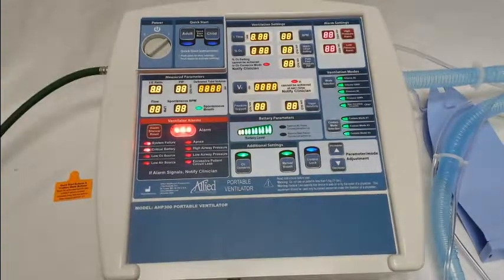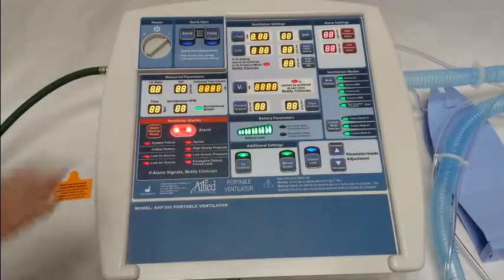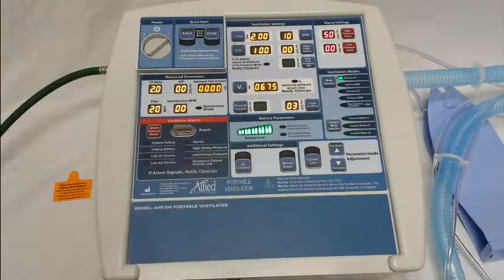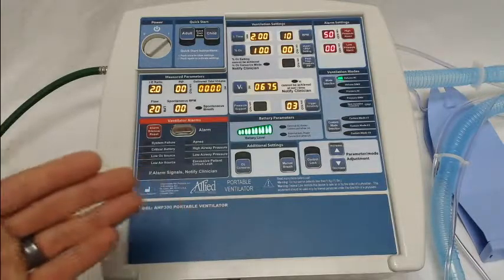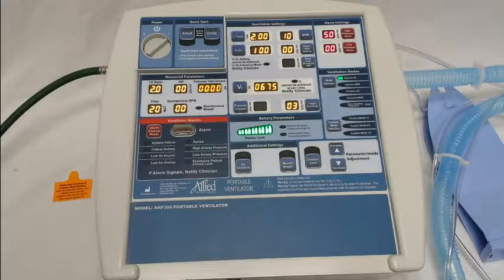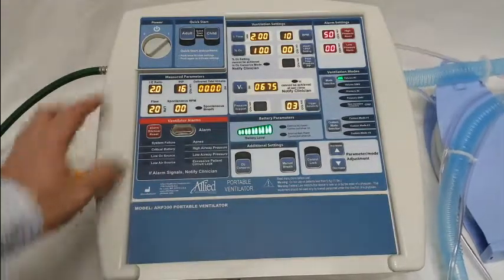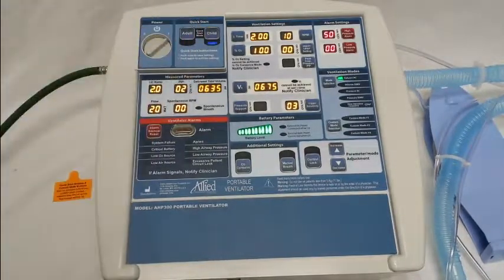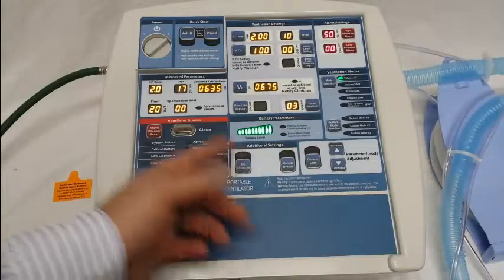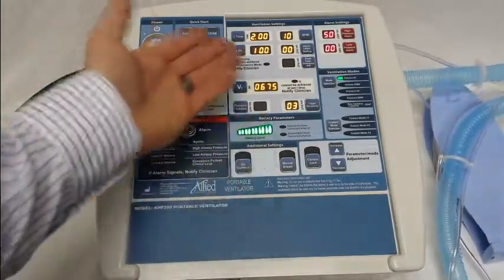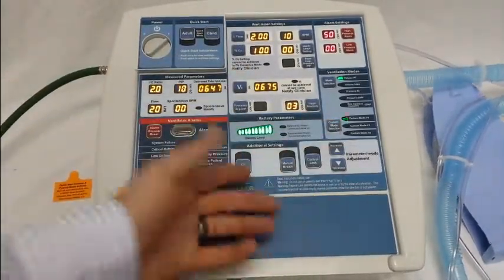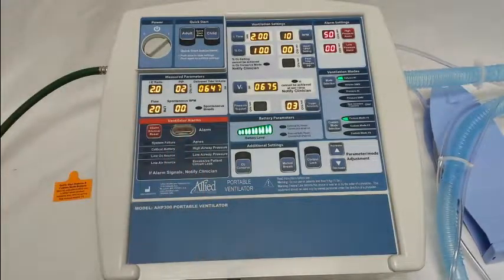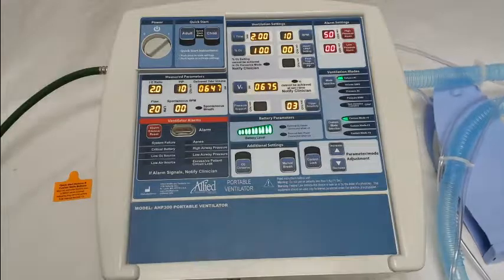Go ahead and turn on the ventilator. The first thing you'll notice is it'll go through a self-check and then it'll start ventilating in whatever settings the ventilator was turned off in when it was shipped from the factory. You will notice that the adult mode, the child mode, and the custom modes, when you press them, they beep and they will not allow you to use them. That's because they need to be either confirmed or programmed to whatever settings you'd like to use.